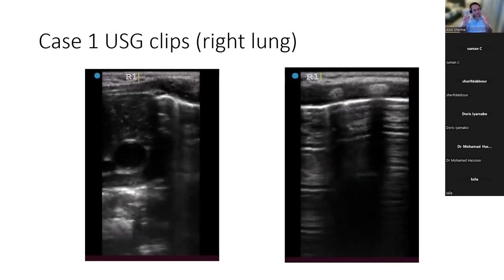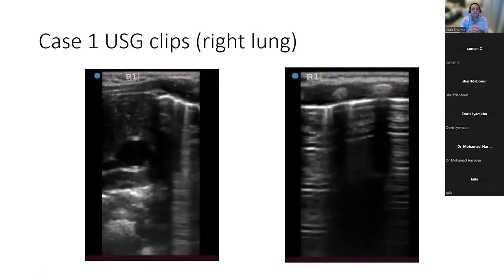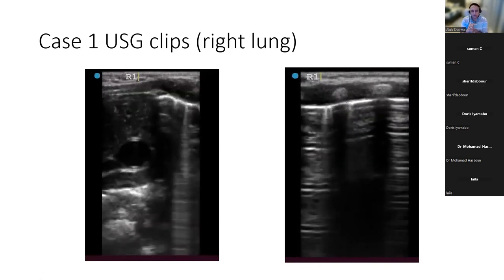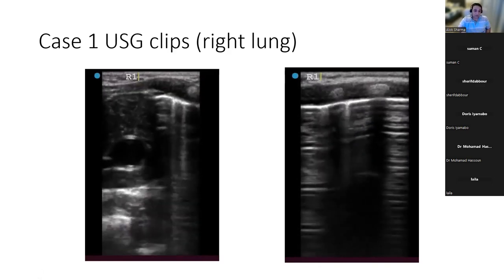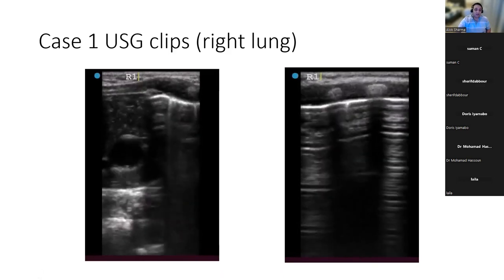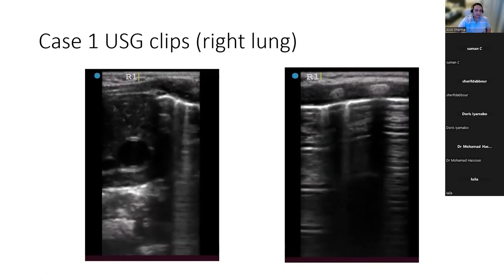So always just remember your protocol. You must demonstrate a bat sign. You must interpret from the pleural line below. Now, that could be a consolidation, but the reason I can't comment on it is above it, I can't see a rib space, and that's thymus. That could be other tissue.